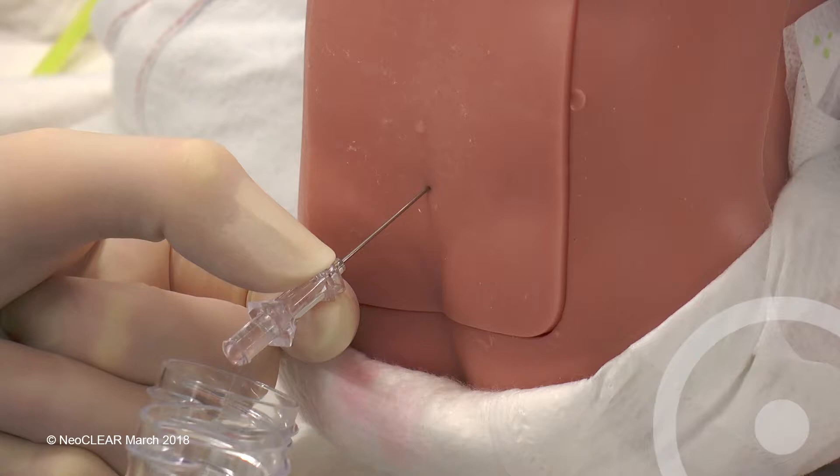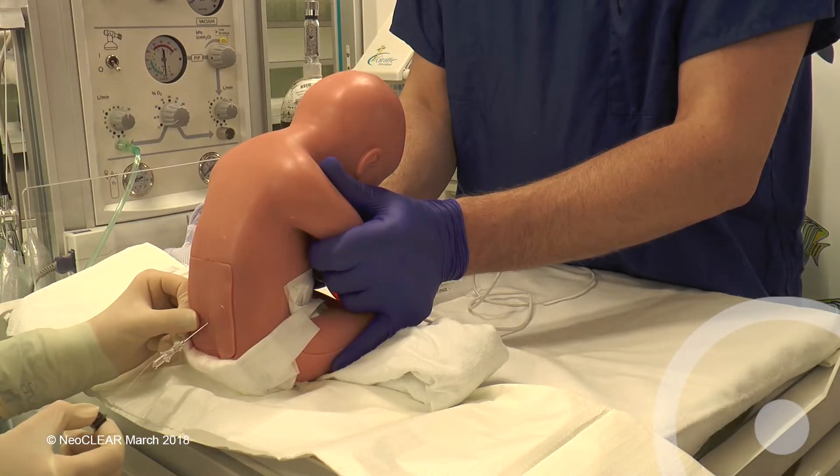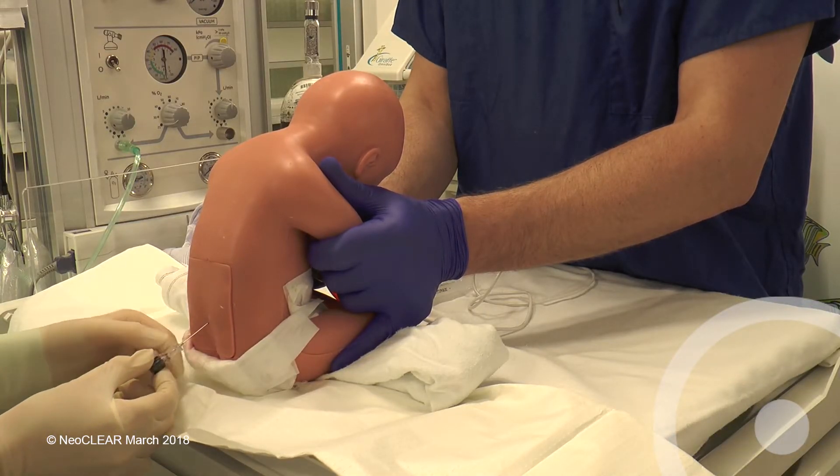If the needle position needs to be adjusted, please replace the stylet each time. Aim to collect into each sterile pot five drops in a preterm baby and eight drops in a term baby. Replace the stylet, remove the needle and apply sterile gauze.